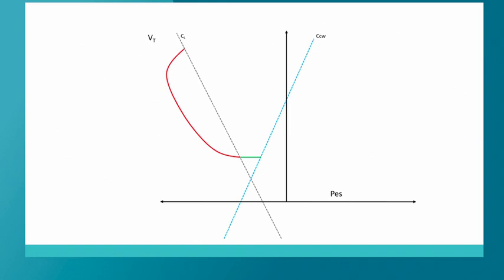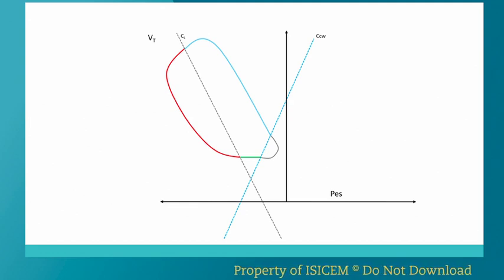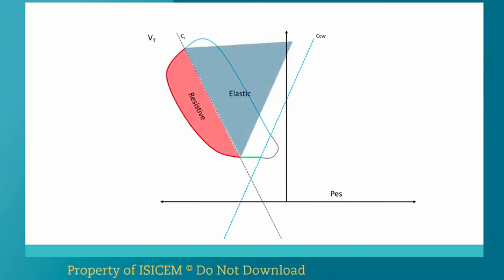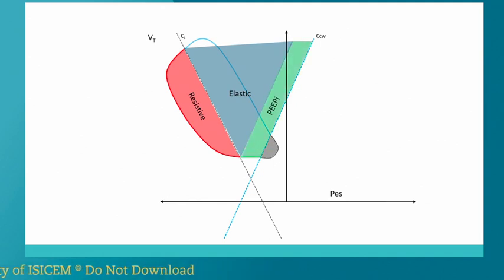Then you have, again, the same resistive component, the elastic component, and you can even, if the patient is making, say, expiratory efforts as well, you can see that there's pressure being generated farther away from the chest wall compliance situation, basically. And again, you can divide these components into resistive, elastic, intrinsic PEEP, and the expiratory effort part, say. So this is a little bit more fancy.